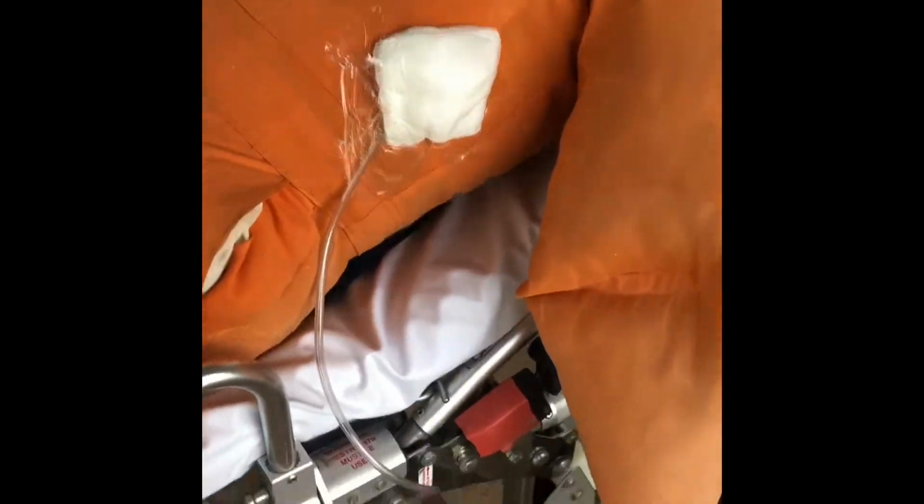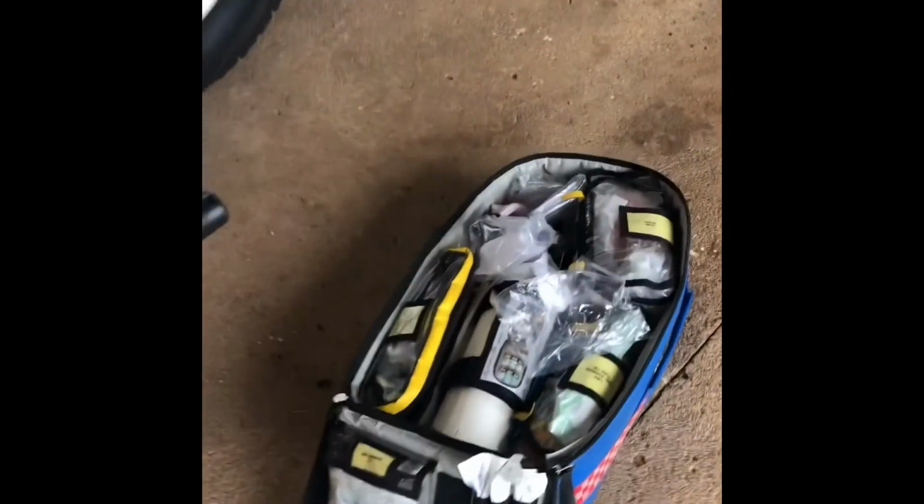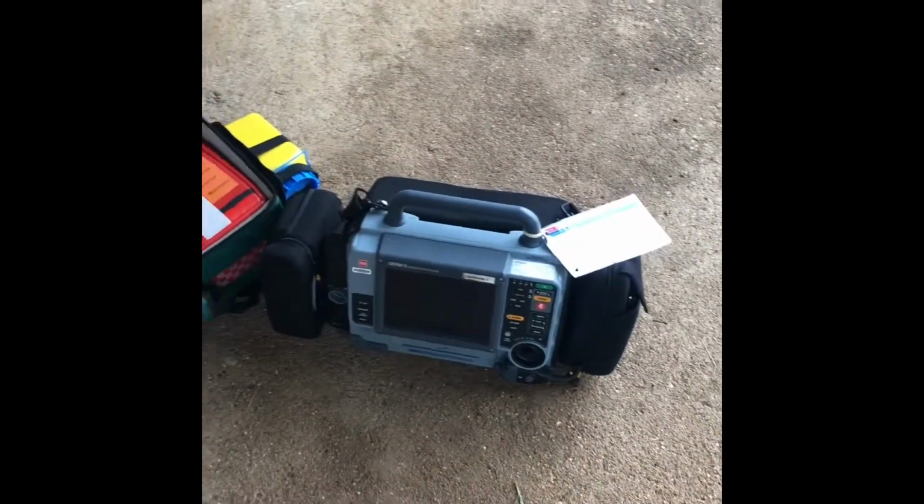We'll require a patient with a chest drain. This will be connected to an underwater seal drain seen here on the cardboard. This may be required to be connected to suction, so we'll need a suction unit available. We'll need oxygen in case the patient requires some oxygen. We'll need our observation equipment, cardiac monitor.